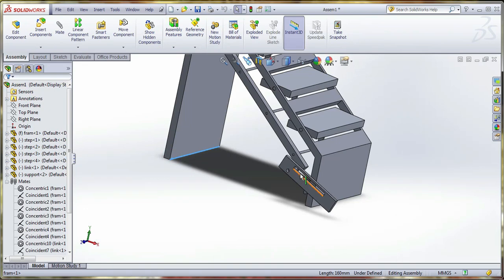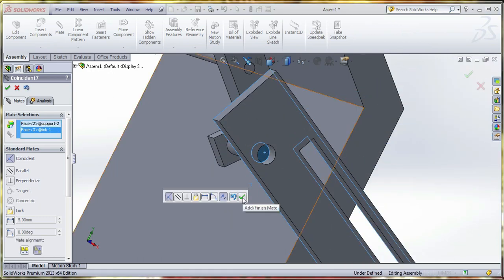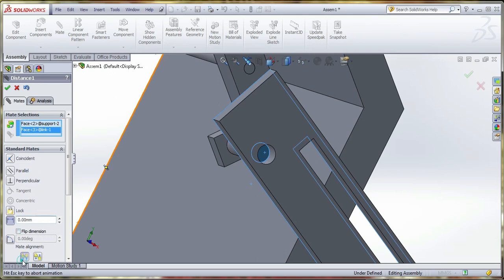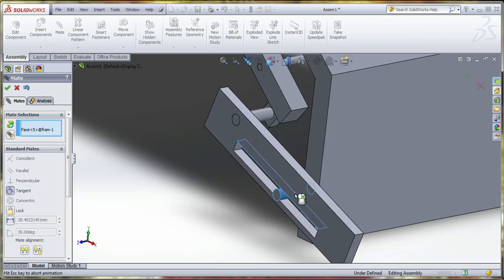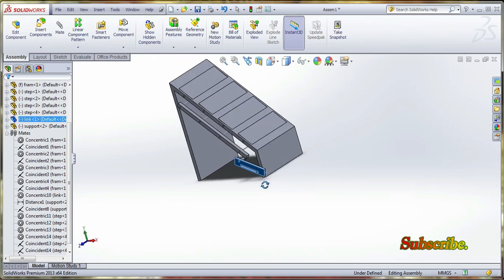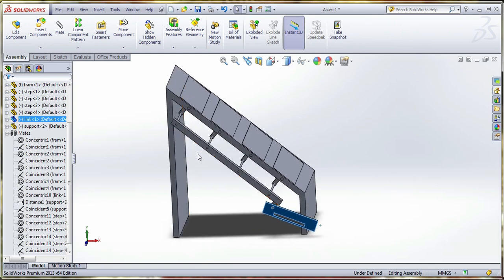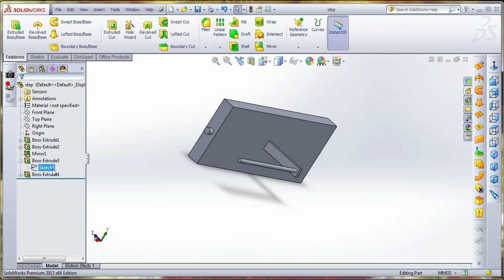Again go for assembly, window and assembly. I have to fix the frame pin to the support pin. Make a tangent. Okay, the assembly is completed. Now right click and drag, and it automatically makes the animation. The step moves. This location is somewhat hidden in the frame, so you can reduce the step extension. The step extension should be reduced. This one reduce to 30.